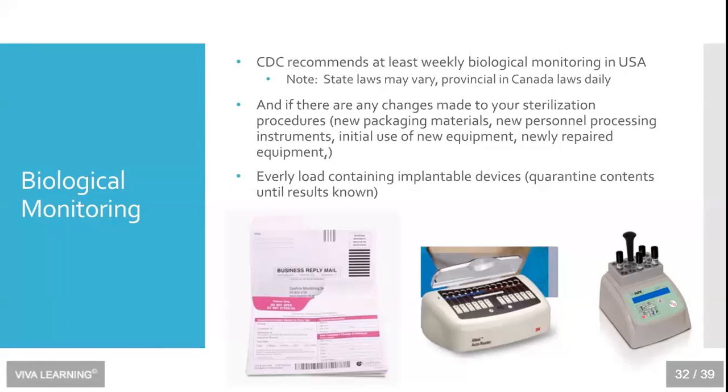Now, my Canadian colleagues typically use the devices as seen on the lower right and the middle of the slide, and these are tabletop incubators where you can perform the spore test and incubate in office and receive the results typically that day or within 24 hours. And because you have more frequent requirements for monitoring, it's necessary to have these.